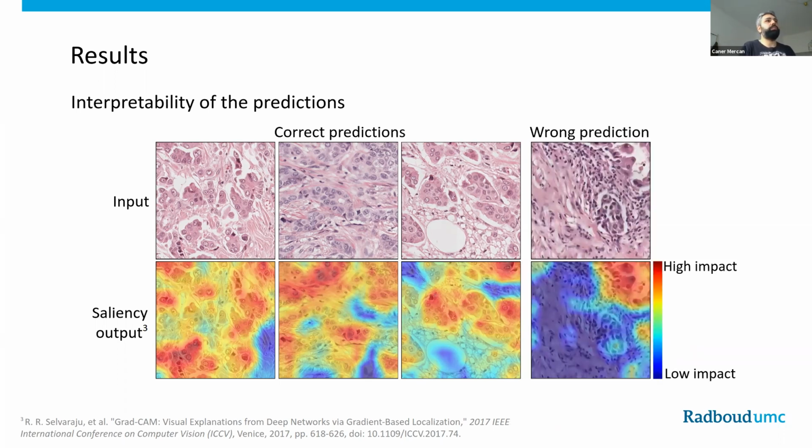However, in a few cases, such as the one here, the system overlooked the nuclear structures, basically, thus making a wrong prediction. However, this problem can be bypassed, as I saw, by processing multiple overlapping patches from the same area with small displacements and average pooling the predictions, basically. And the occurrence of this problem was few and far between.